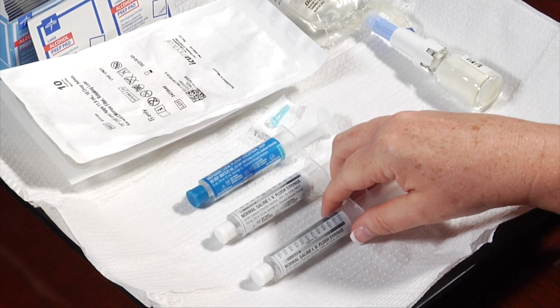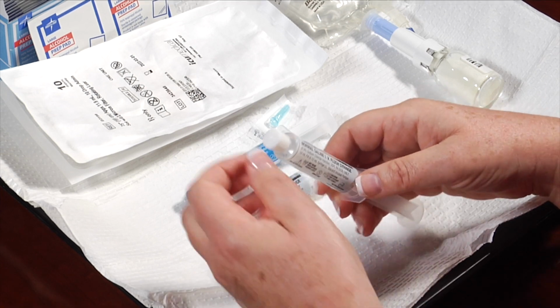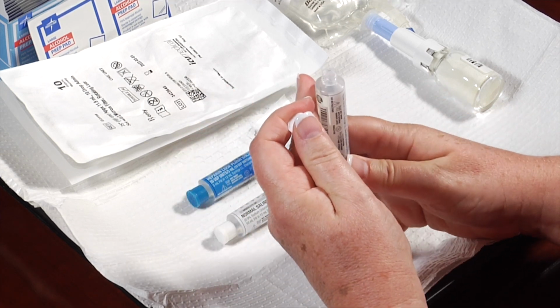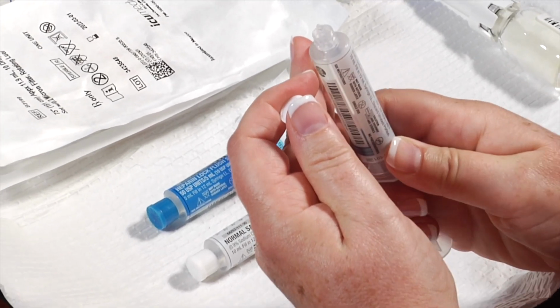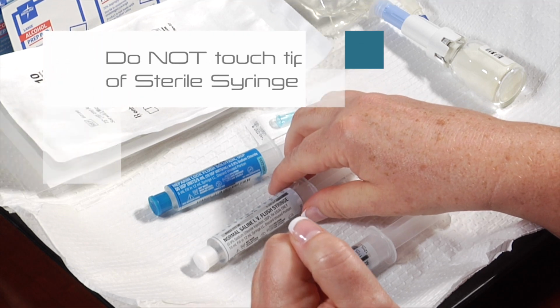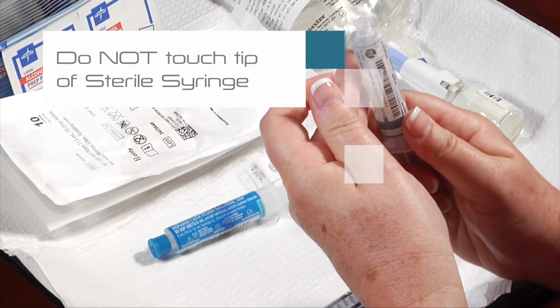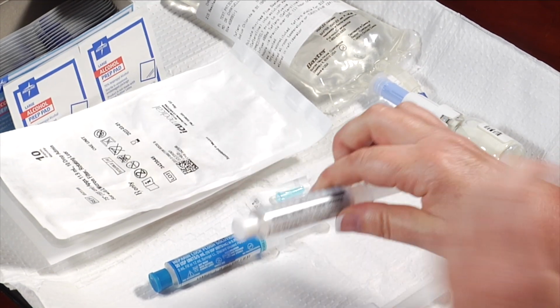Prepare both pre-filled syringes of sodium chloride, also known as normal saline, and heparin if necessary by holding the syringe with the tip in an upright position. Gently pull back on the plunger, then push gently forward on the plunger to expel any air that is in the syringe. Do not touch the tip of the sterile syringe. Repeat this procedure with each syringe.